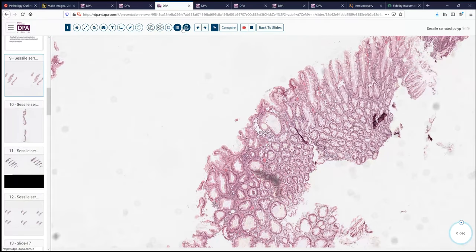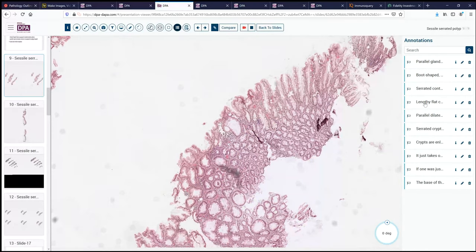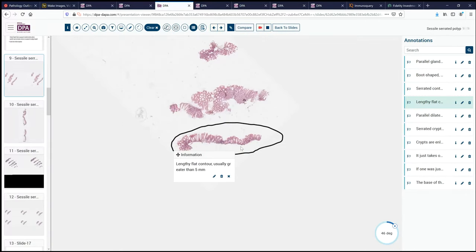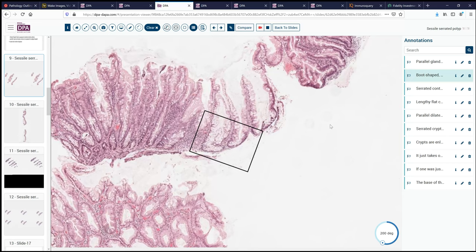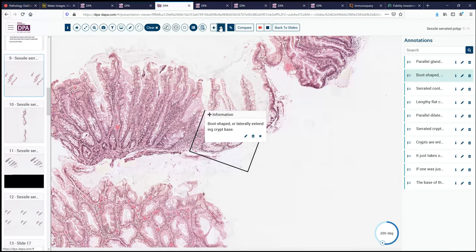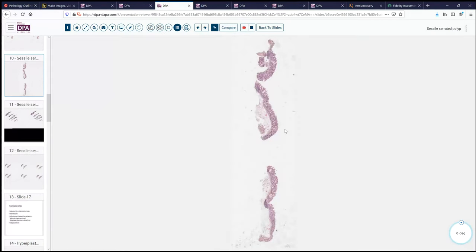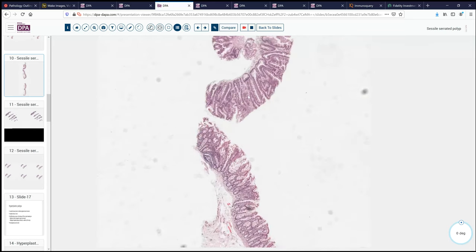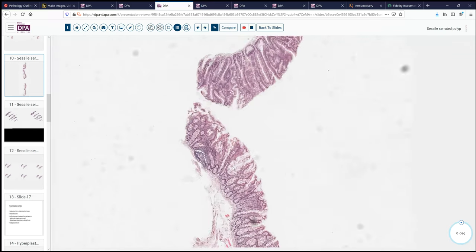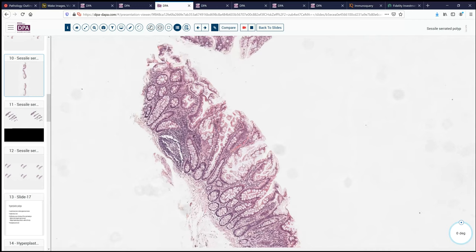Looking at some of the annotations, here we see highlighting the length of these lesions. Here we go to a boot-shaped gland — you can see the boot shapes, highlighting that these crypts are abnormal. On to another example: here again we see a long, mostly flat lesion, and as we look at it we can see there's some complexity to the glandular architecture, and we can see this serrated pattern quite easily. Sometimes it's present throughout the gland, and sometimes it's more focused towards the surface, occasionally just involving barely the surface. You have to be alert for that.